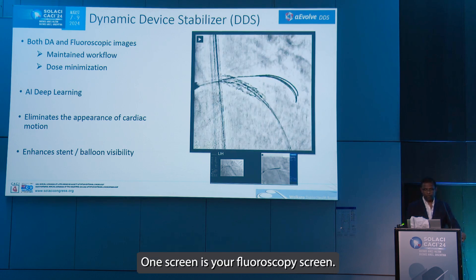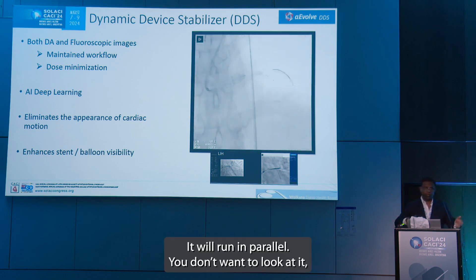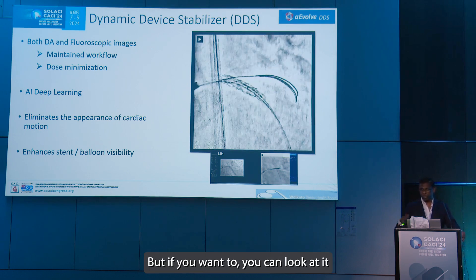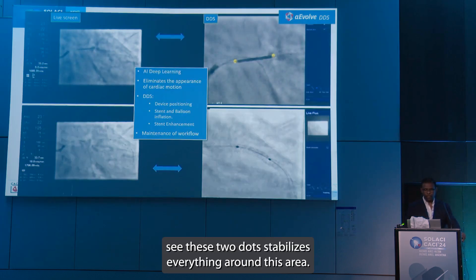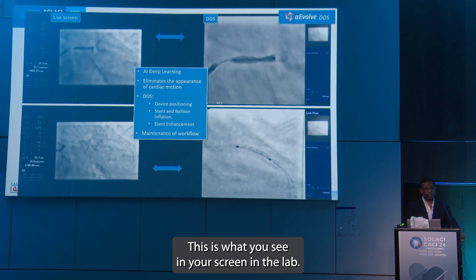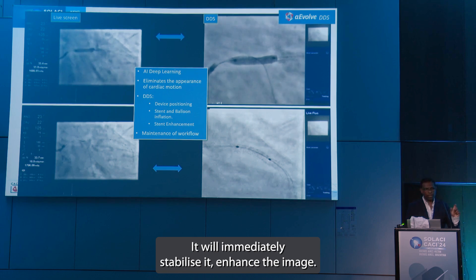Now, do you want to use it or not — it's your choice. There are two screens here: one screen is your fluoroscopy screen, the second one will be your DDS screen. It'll run in parallel. You don't want to look at it, you can carry on the way you normally do your case, but if you want to you can look at it and enhance the procedure as you go through. It pretty much immediately sees these two dots, stabilizes everything around this area, and this is what you are currently working with — this is what you see in your screen in the lab, and this is what you get when you have DDS: it will immediately stabilize it.